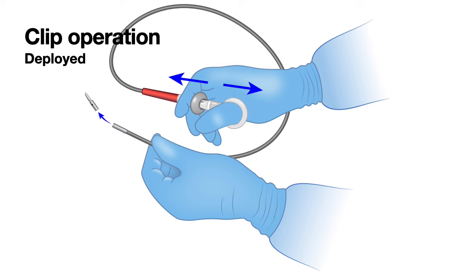So this is very important for a good outcome. Otherwise, what happens is if you accidentally deploy after closing, the clip is deployed, you wasted a clip, and the endoscopist will struggle to find a suitable place where he can catch that bleeding vessel. The clip is occupying the real estate there and not doing the job. So important to keep this thing in mind and think in your mind, clip open, clip close, and only when the endoscopist says deploy, you should deploy. I hope you got this thing right.